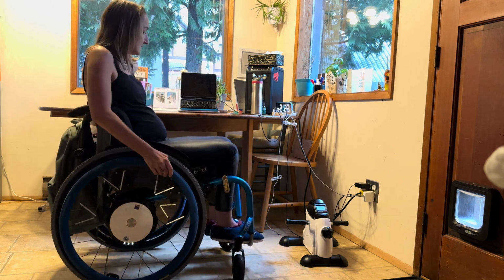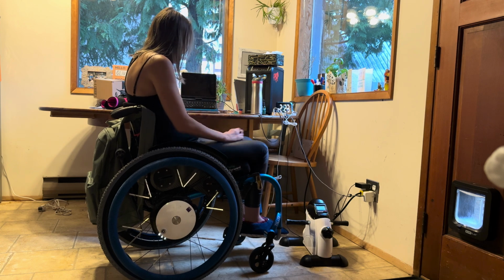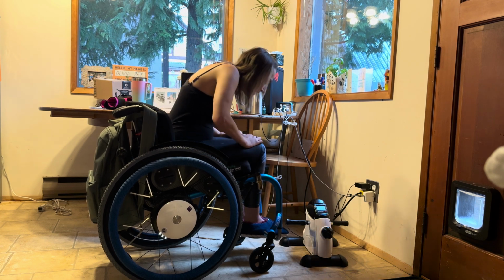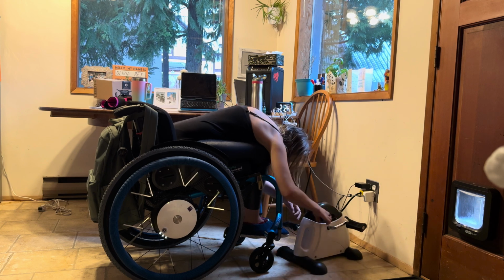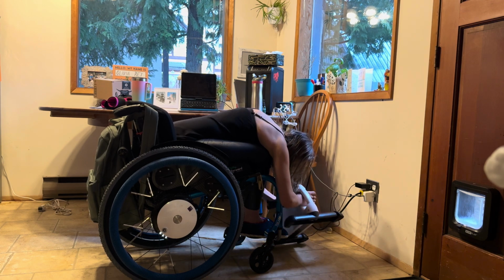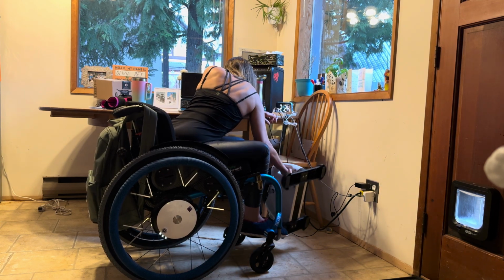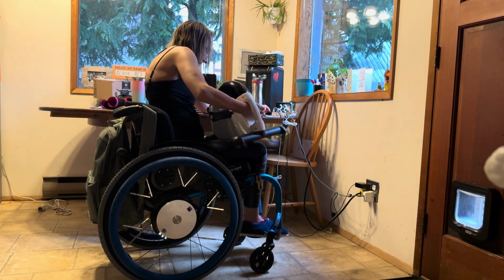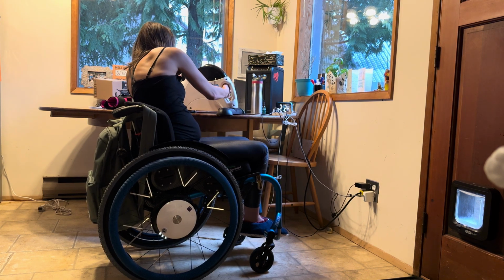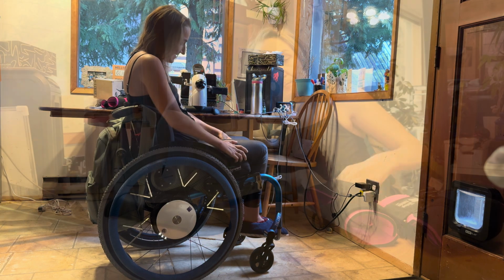So what I do, I normally sit parallel to where the table is, then put my brakes on, making sure that I can put my arm up here, so I can leverage myself up since I have no abdominals. And going down there, put the handle on the other side, so the hand that's doing the lifting is going to be the hand that's the furthest from the table. And then I'm going to be pushing on the bike, putting my arm on the table here, putting the bike on my lap, and then putting my elbow on the table and setting the bike on the table. And there you go. Now I'm ready to go biking.